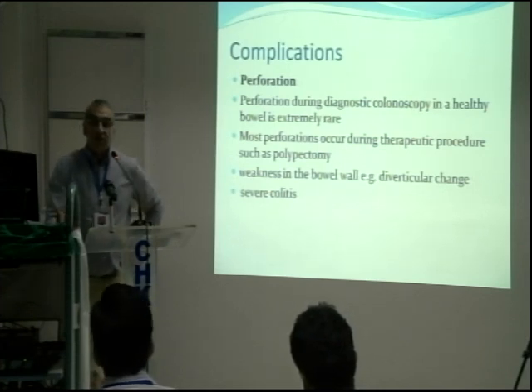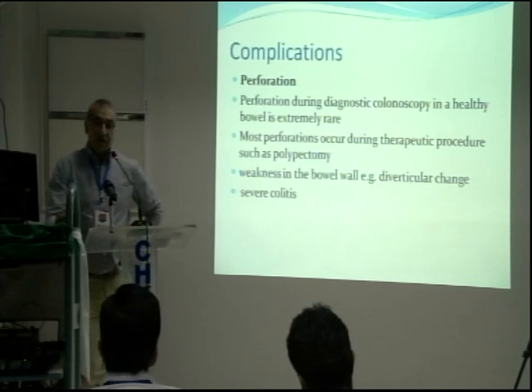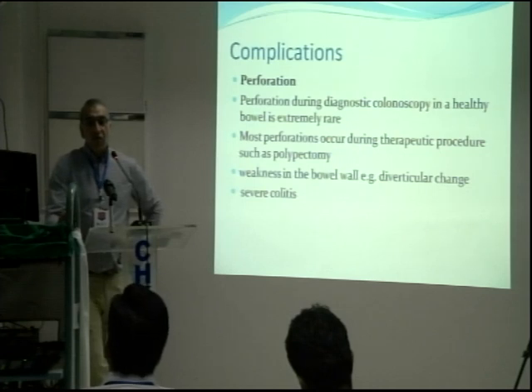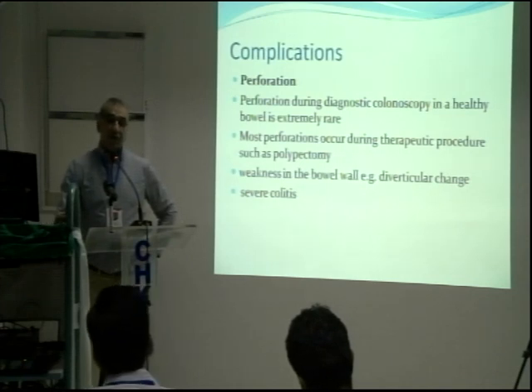No, there's nothing. You can do it with an INR as high as 5. It doesn't make any difference. There is no particular concern, because in a pinch biopsy you just take a biopsy and you look at it. If it doesn't bleed, you are okay. Right, okay.